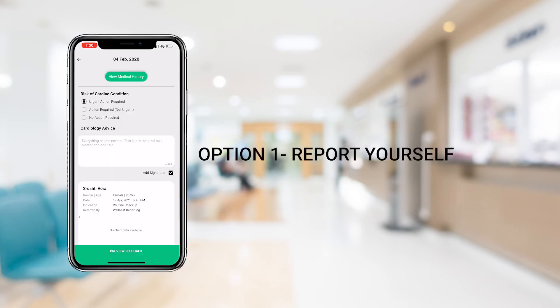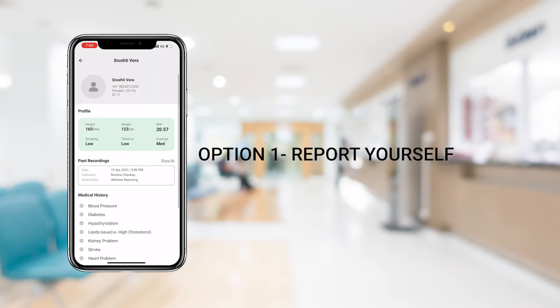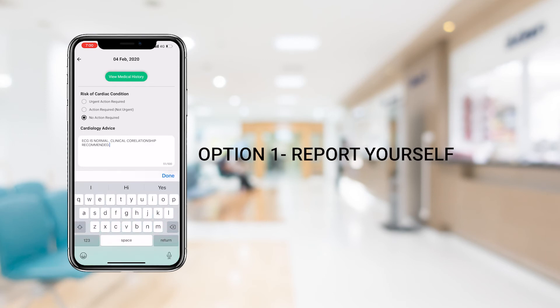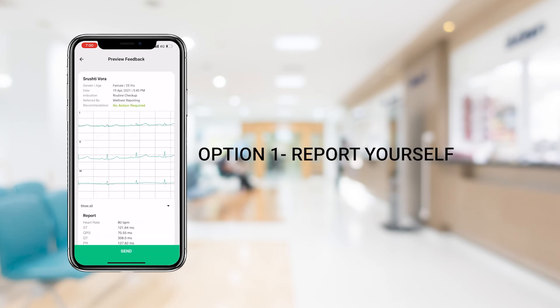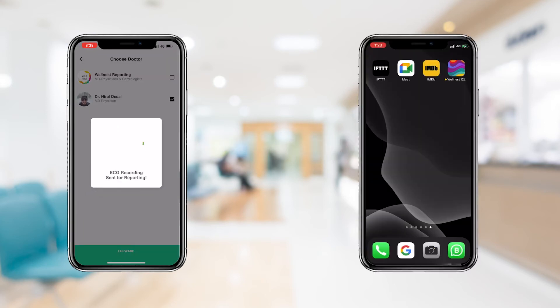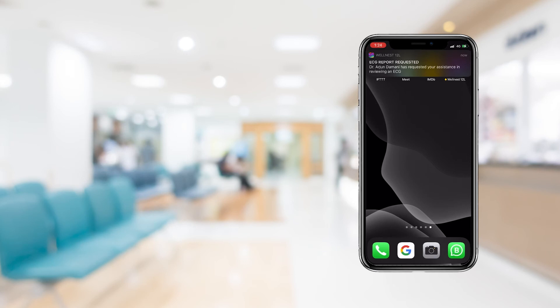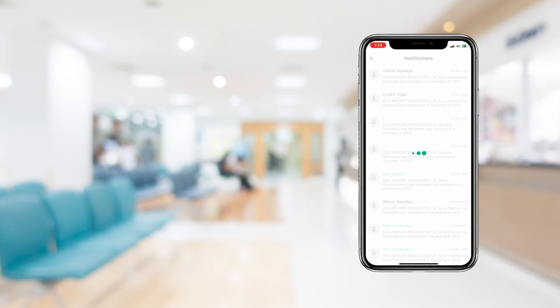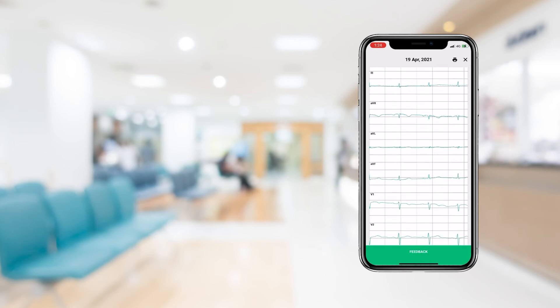If you are a doctor, you have the option of reporting the ECG yourself via the app. You can check the patient's medical history, including their past ECGs, and then simply fill out your findings and recommendations and click Submit. Alternatively, the ECG may be shared for reporting by clicking on the Send for Reporting option. You will be able to see the doctors associated with you and your organization here. The selected doctors will be notified of the ECG reporting request on their 12L app, and will also be able to review the patient's relevant medical history, symptoms, and ECG and report via the app.